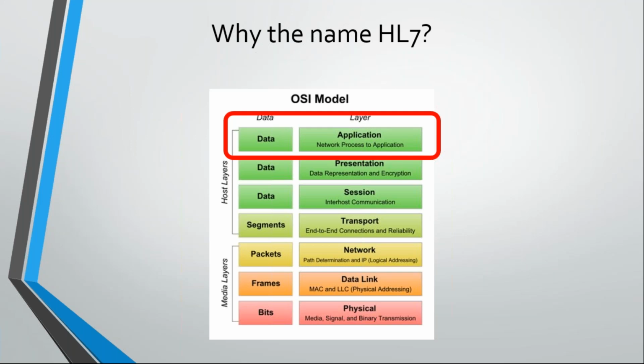I'm not sure how many of you know what the OSI model is. We will not be taking a deeper look at it. I'll just quickly brief on what this does, and if you want more information, you can just go ahead and Google it and take a look. So OSI is nothing but Open Systems Interconnect.